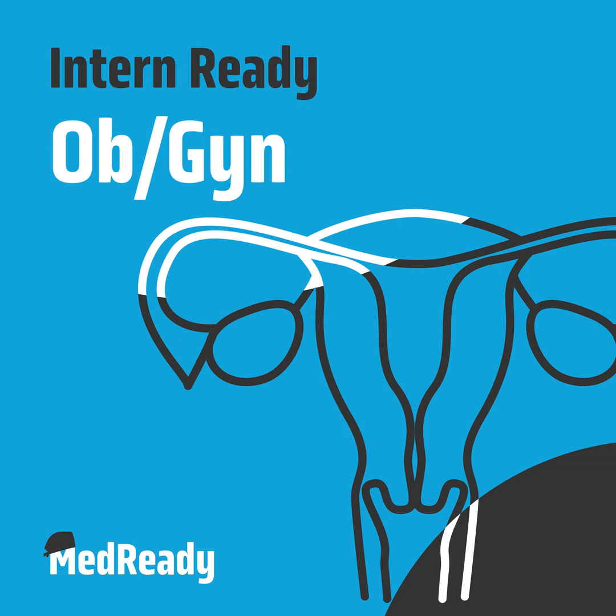I think this was the one I was always the most nervous about as an intern, and I'm still nervous about. Half of them are related to dilation and just actually trying to enter into the uterus. So sometimes when patients have super stenotic cervices and you're trying to get a dilator through, if you feel a lot of tension and you don't feel comfortable, it's completely understandable to ask your attending or senior to try for you. I think I did that many times as an intern just to understand how much force to really give.